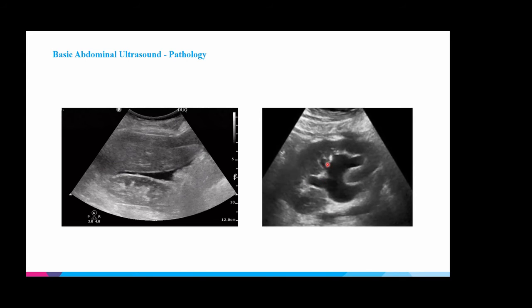You can imagine these are little fingers. This is a palm. This is a thumb, maybe, or it looks like some weird animal or seahorse or something. But anytime you see black in the center of the kidney, that's abnormal and makes you worry about hydronephrosis. Okay. So for the patient, I would then look at the bladder and make sure it's unilateral versus bilateral. Is the bladder distended? This patient maybe needs a Foley.